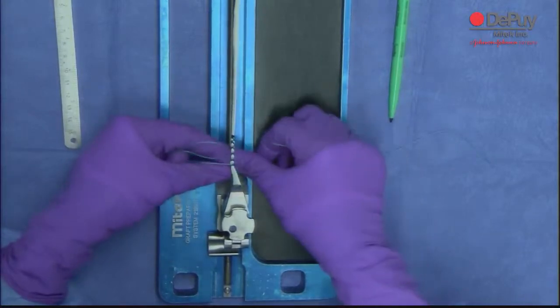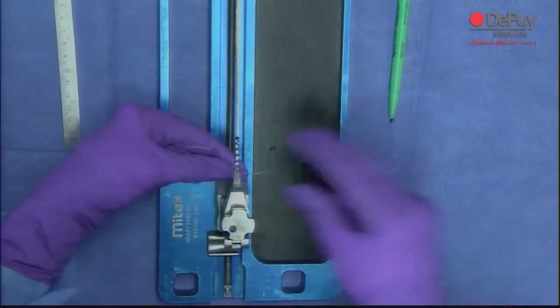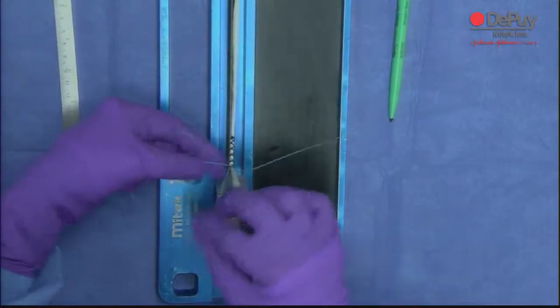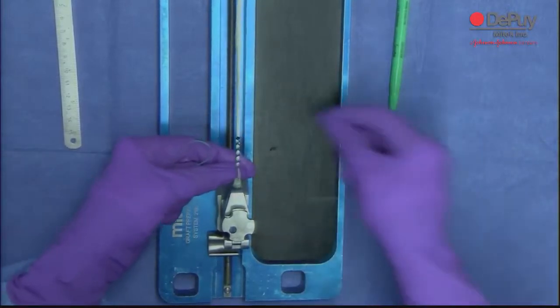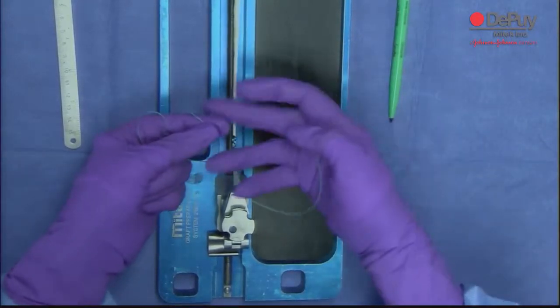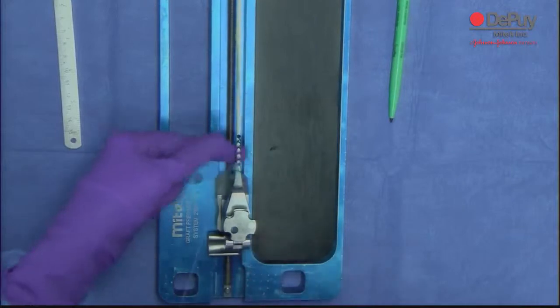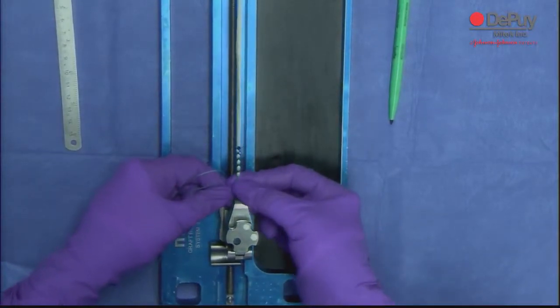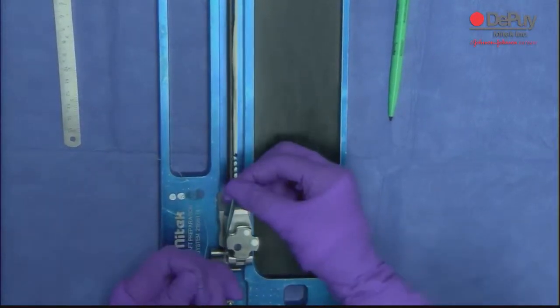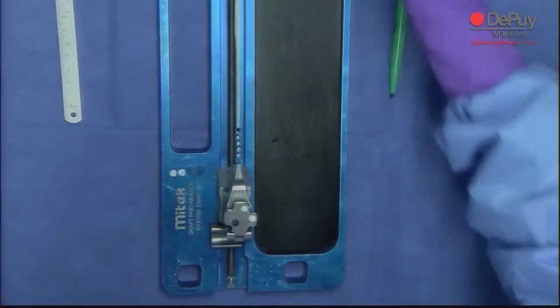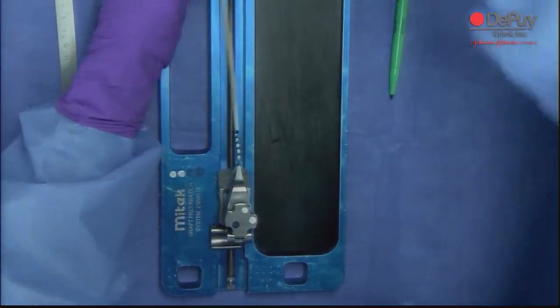Now again, suture underneath, on top, suture underneath. Bring this underneath, through here, tighten it up. This allows the tension to continually be pulled on this graft. So we're done with this.